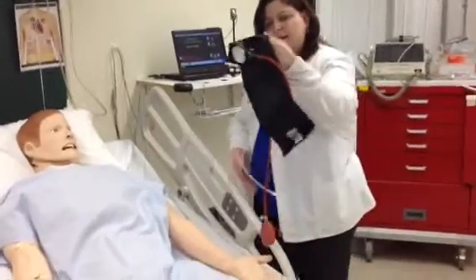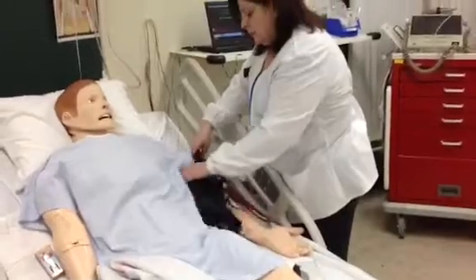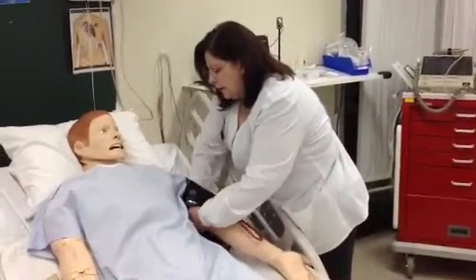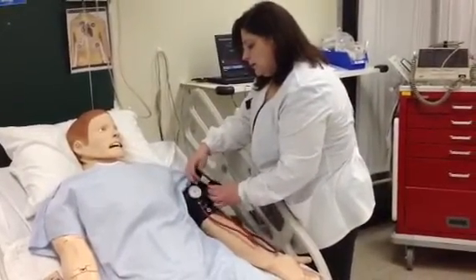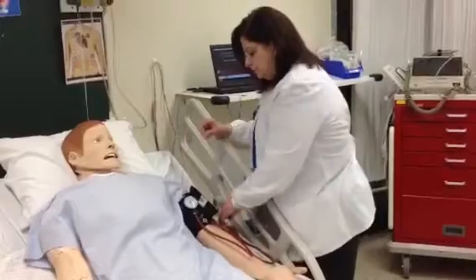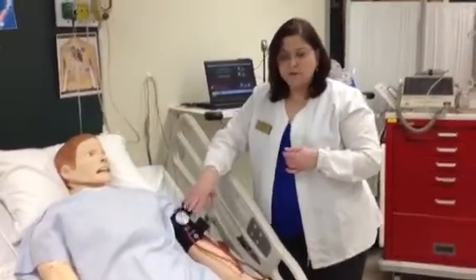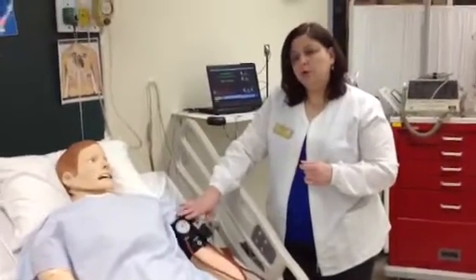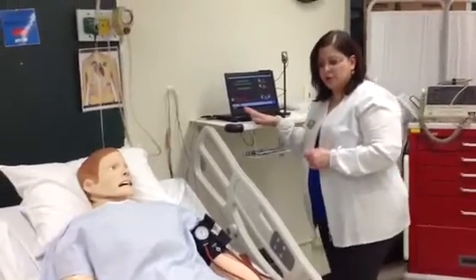This tube does not need to be connected to anything. You can take SimMan's blood pressure manually. However, I have found that the noises are really too mechanical, and it is more of a distraction. I know that you know how to take blood pressures because you had to test out on that. So you will be able to use the machine to take his blood pressure.